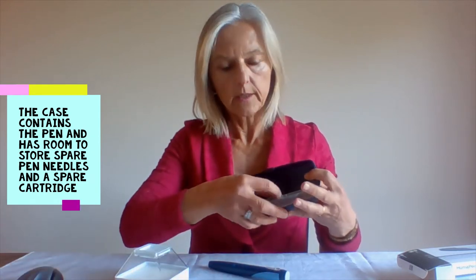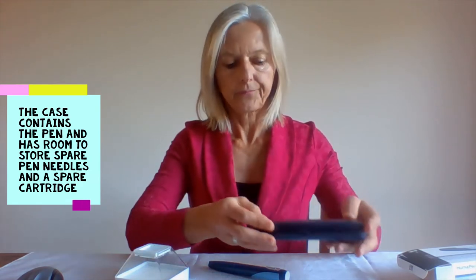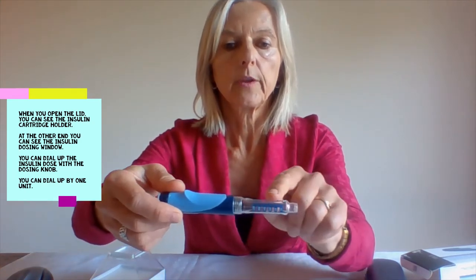This box contains the pen and has some slots for pen needles and a spare insulin cartridge. You open the lid and you can see a cartridge holder and an insulin dosing window. This is where you dial up your insulin dose.